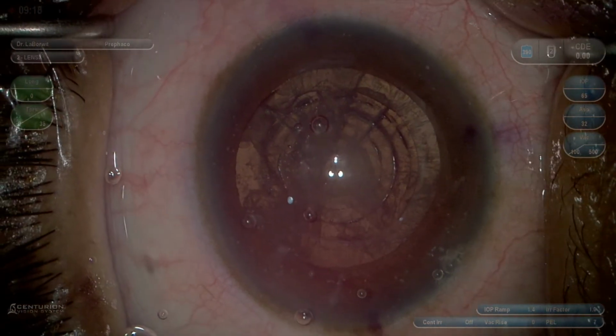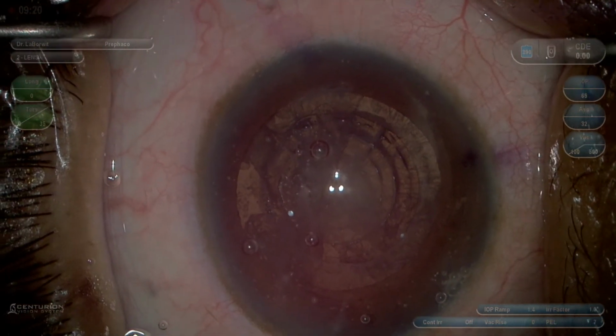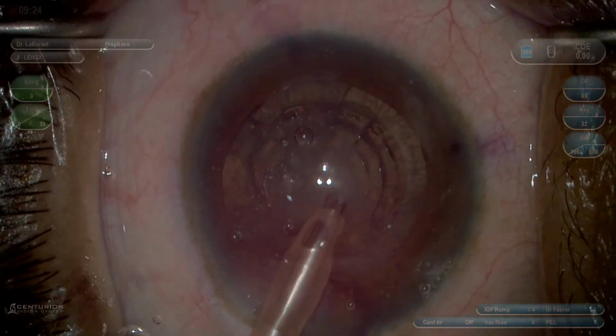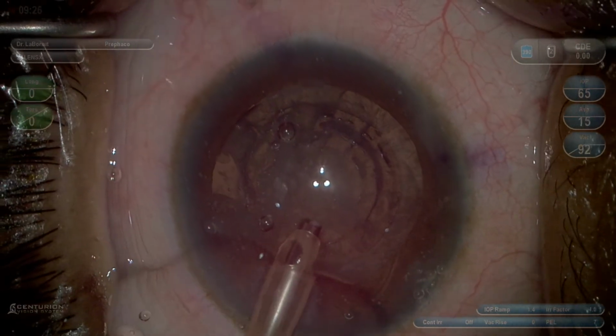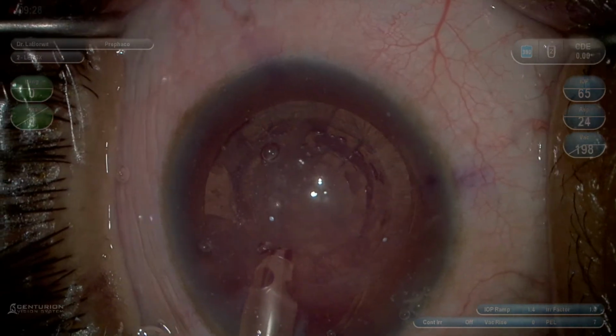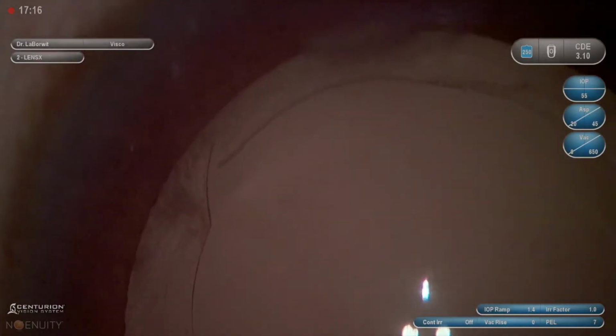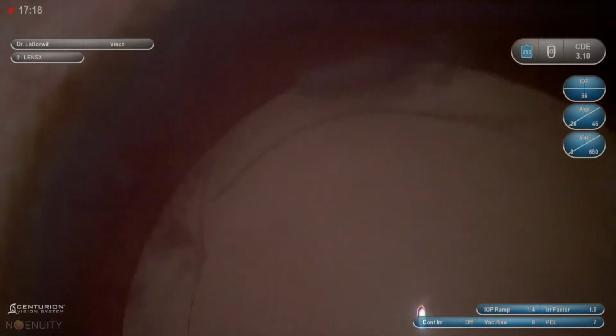Next, I'll go ahead and do the phacoemulsification. There are other videos that show how I do a different technique in FLACS, and I believe there's much less stress on the bag during removal of the nucleus in FLACS, which would be beneficial in these cases.